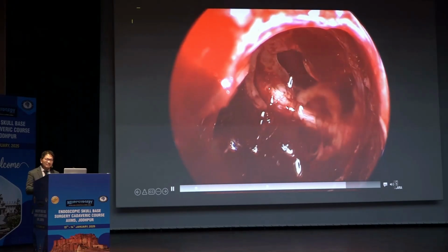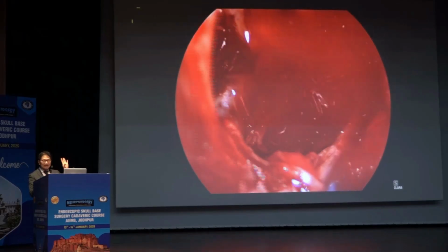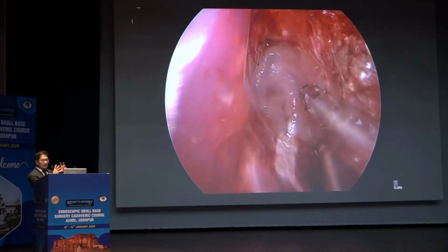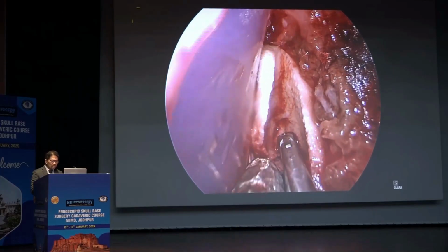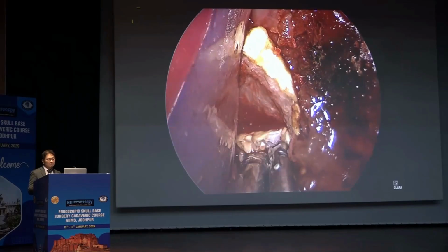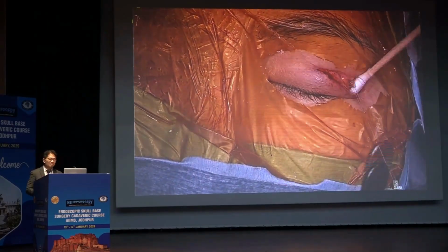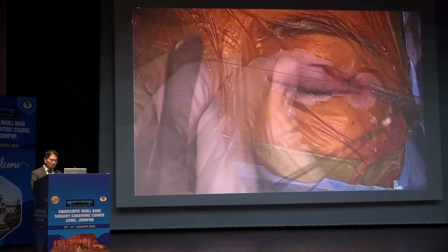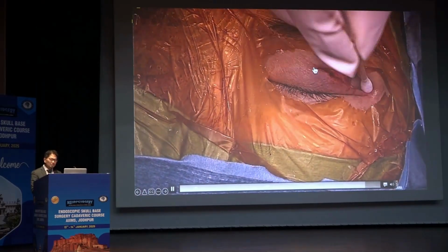In many cases, it's very difficult to identify the oculomotor nerve because, in many cases, it is displaced. We need the angled endoscope to identify the oculomotor nerve. And the reconstruction technique is very simple. We don't have to use fat graft materials for me, but my colleagues prefer to use fat graft materials. It depends on the surgeon's preference. Only the absorbable sutures, subcuticular suture, only small incisions.